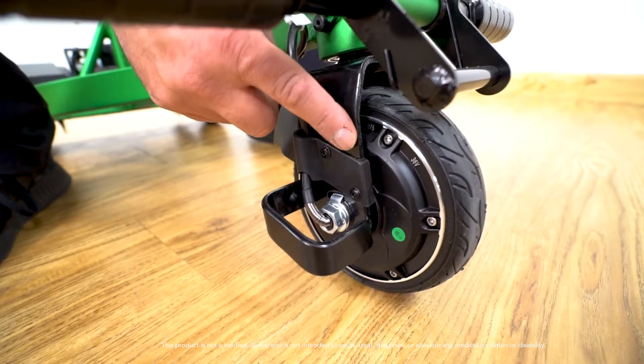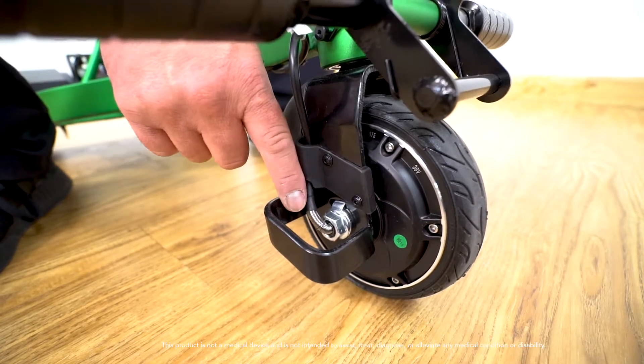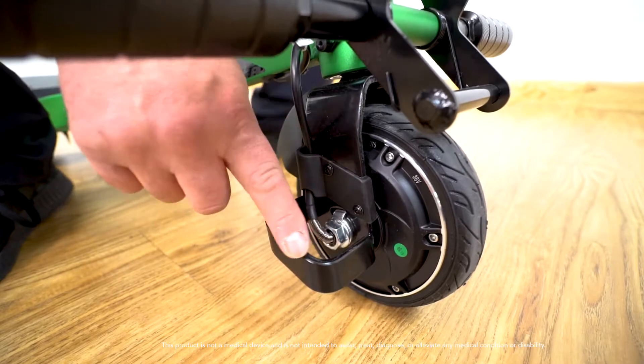The front tire is also the hub motor — this is what makes the iRide move. The safety guard on the side of the hub motor is there to protect the motor harness from impact damage.